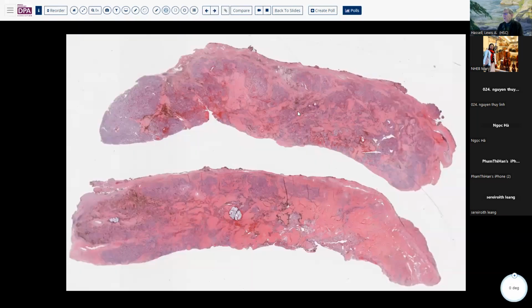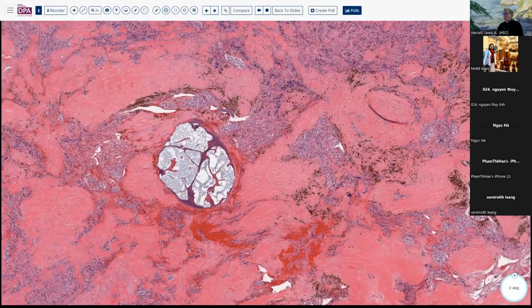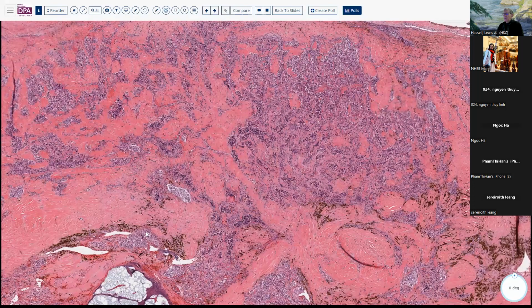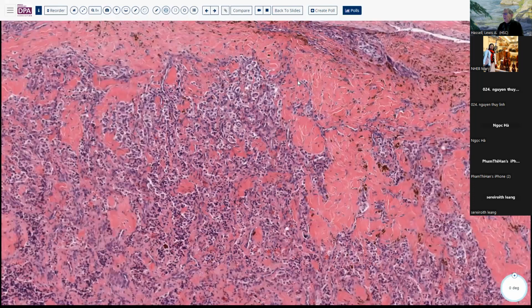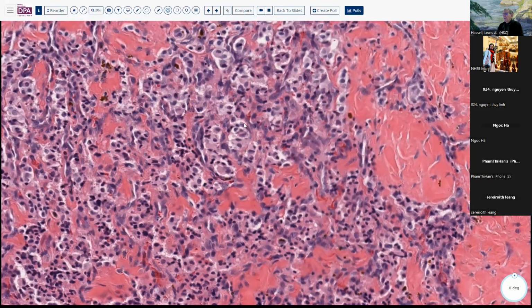And then another example, I think this one is from the adrenal. In this case, because of the vascularity, radiologists have tried to embolize the tumor. And so you get a little bit of this embolization material in the vessels and associated hemosiderin deposition from hemorrhage. Again, we see a lot of this hyalinized collagen, small nests and balls of cells with characteristic sustentacular cells.